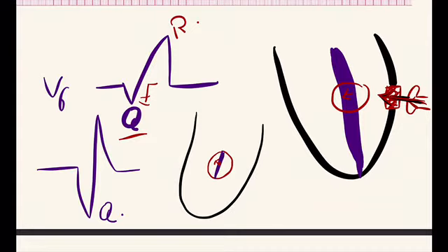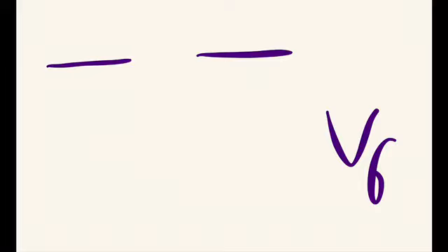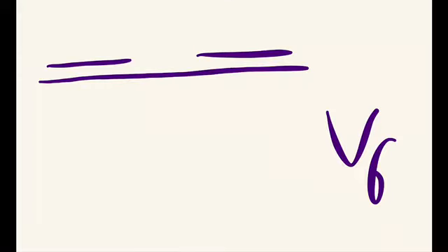Now why is there ST segment elevation? There are a lot of theories on this, but the most accepted theory is that there is no real ST segment elevation. So what does that mean? Let me discuss it here. Suppose, guys, here is one line, and here is another line. You can say that both lines are in a plane, in a 2D plane.